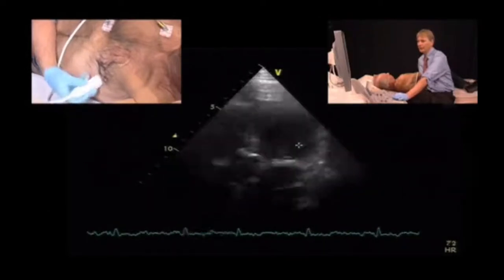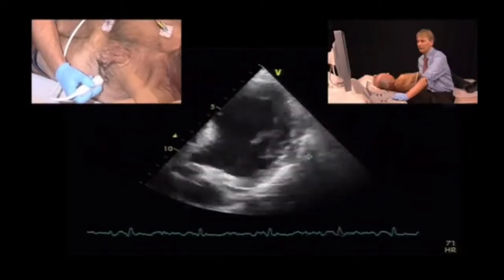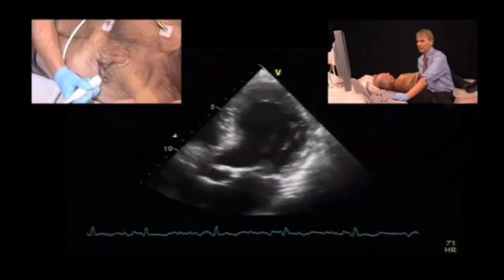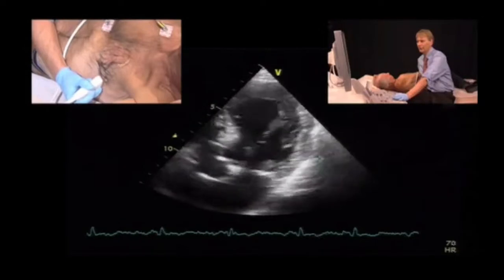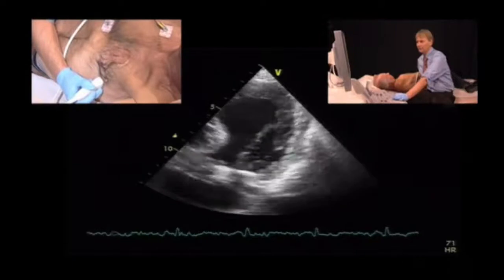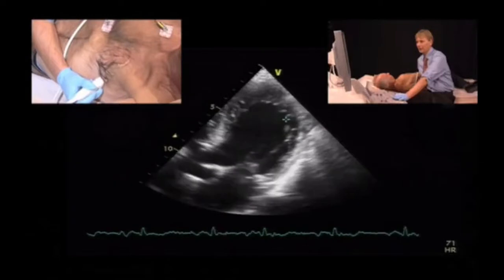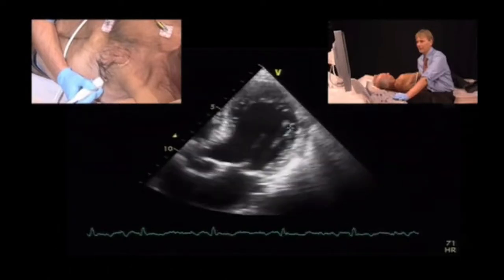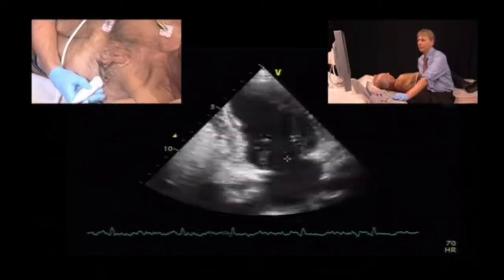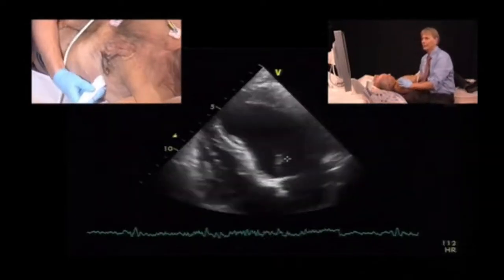And to really look at the entire myocardial function and the entire regional wall motion abnormalities, it's always good to also look at the view where you rotate the transducer from the four-chamber view clockwise towards the lateral wall here. So again, you see regional wall motion abnormalities here all the way to the mid-lateral wall, which means that there is an infero-posterolateral infarct.